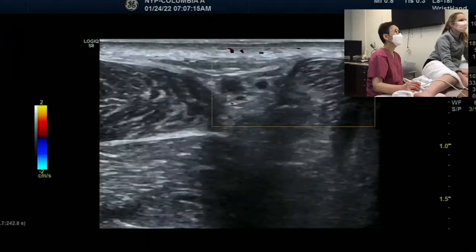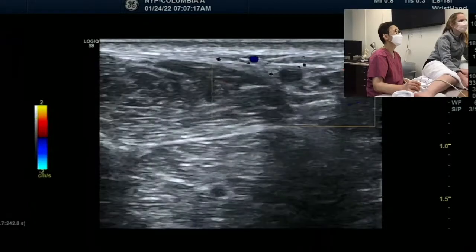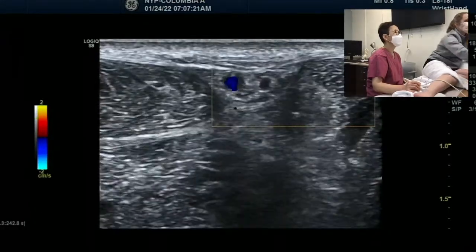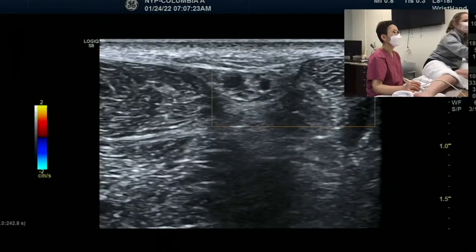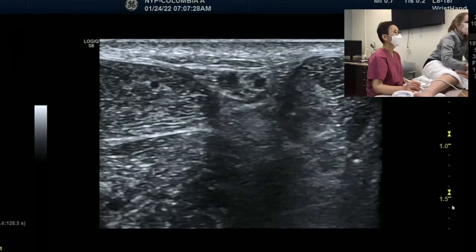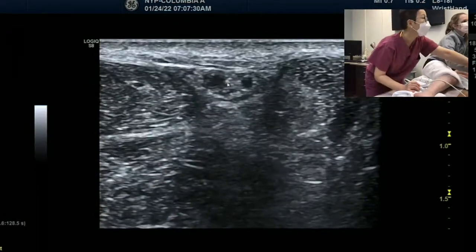I think maybe the color flow is a little less in my venous system. Oh, there we go. So underneath or next to it. Then you get rid of that. So let me just freeze. Freeze here.